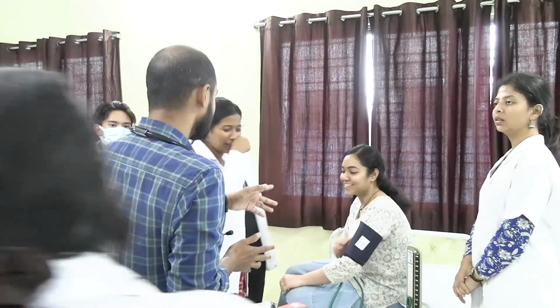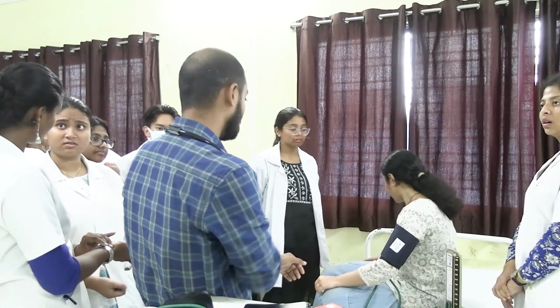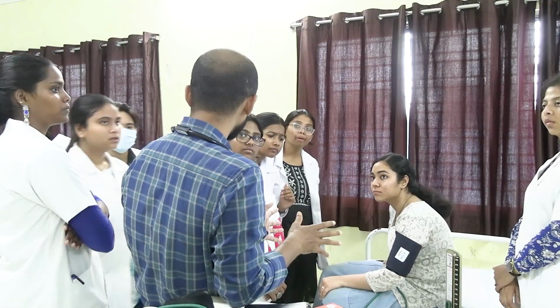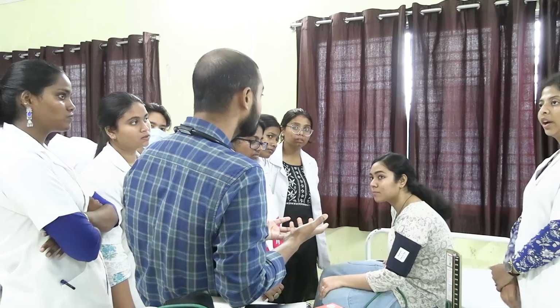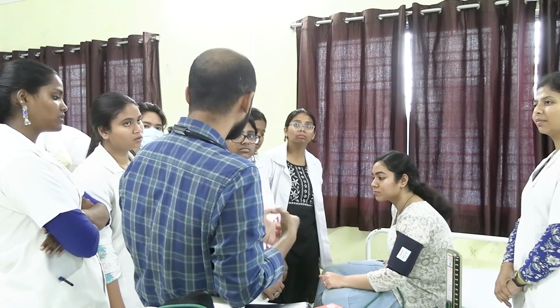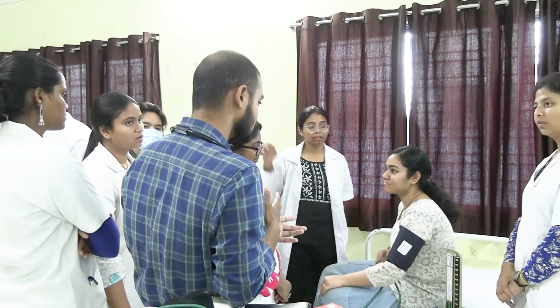Okay, one more thing. When you put the cuff on the patient, don't inflate it and keep it there for a long time. If you take too much time, what will happen? Flow of blood, and what else? There will be spasm, and again you will get a wrong reading. You have to keep that in mind also.